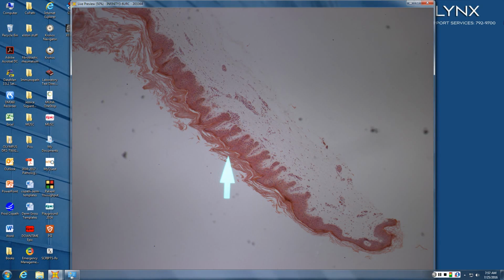So remember, your Seb cell is usually around the size of an acrosyringeal keratinocyte, small, but then you have that large cell variant, which merges with large cell acanthoma, reticulated Seb, and lentigo.